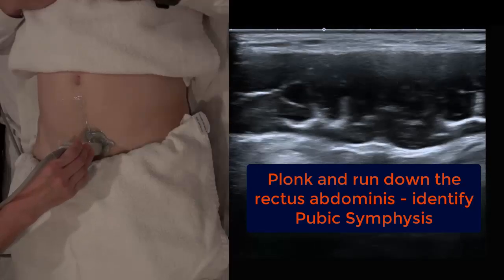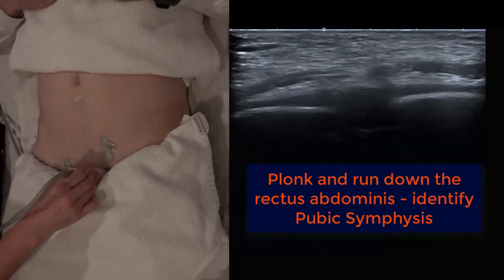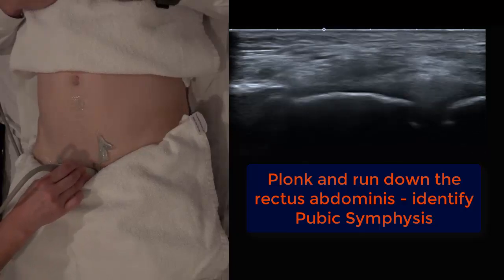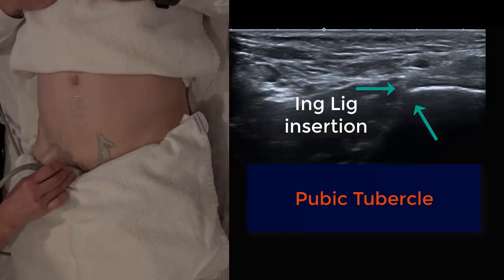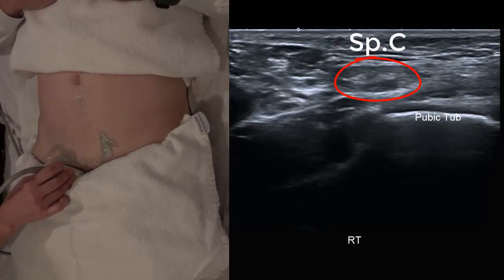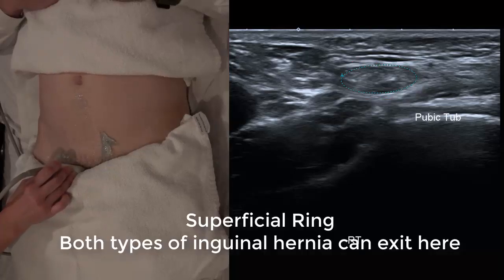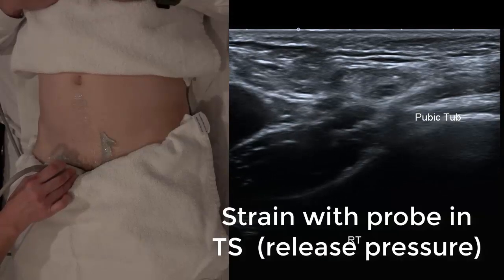Now let's explore a few inguinal canal strategies — this is where a lot of people get hung up on the anatomy. Do a little plonk on the abdomen and run down to identify the pubic symphysis. This is a great place to start for all learning sonographers. As you slide laterally you can see the bone drop off at a slight angle — that's where the inguinal ligament tendon inserts, and also where the conjoint tendon inserts. With the probe in transverse, immediately supralateral is our spermatic cord, or what we know as the superficial or external ring. Both types of hernia can exit here.